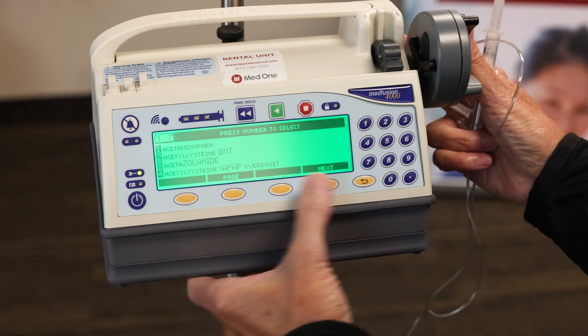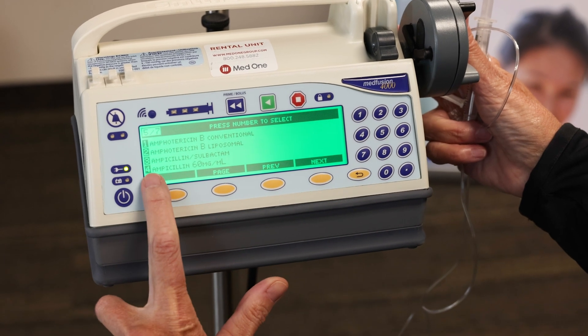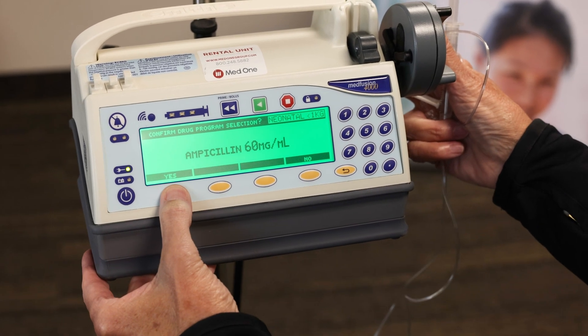Then I'm going to page down or next to get to my ampicillin — one more page, and there we are, number four. I'm using 60 milligrams per mL. Yes, that's what I want.